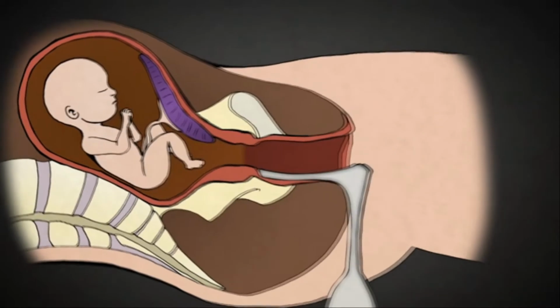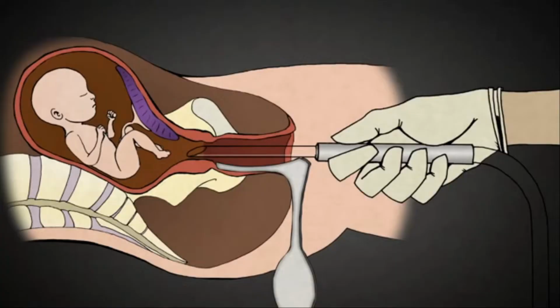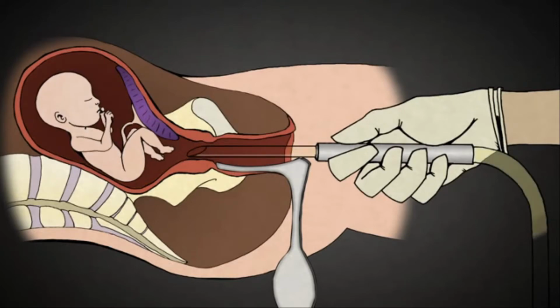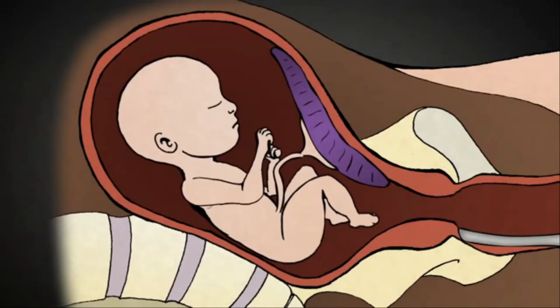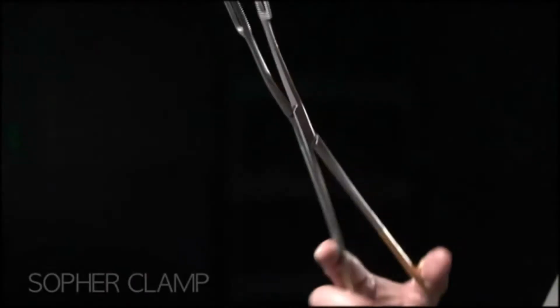Once the cervix has been stretched open, the suction tube is placed inside. A baby at 20 weeks gestation is as big as the length of my hand, from head to rump, not counting the legs. The suction machine is turned on, and pale yellow amniotic fluid surrounding the baby is suctioned out through the catheters. But babies this big, they don't fit through catheters this size. The baby's bones and skull are too strong to be torn apart by suction alone.